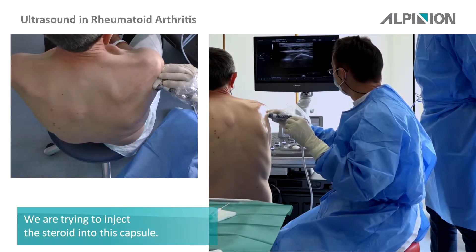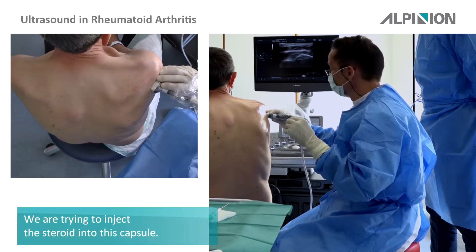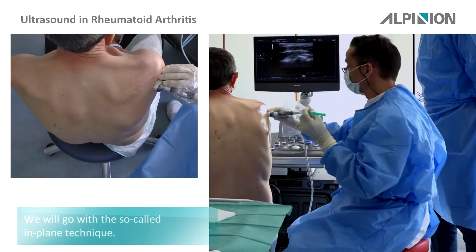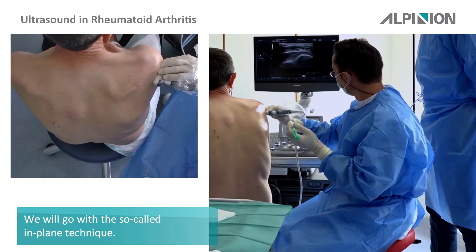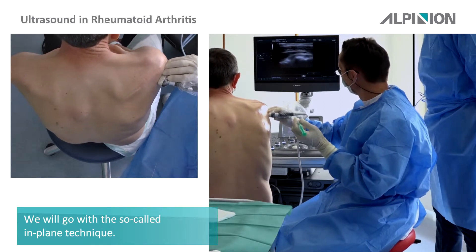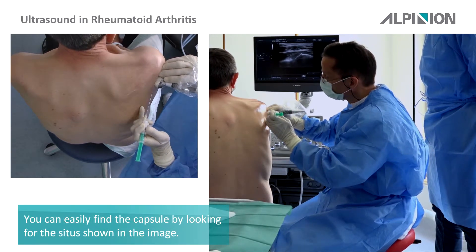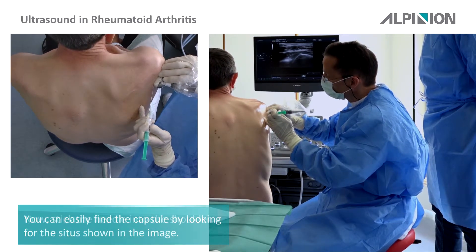We will now inject — we try to inject the steroid into the capsule. We use the so-called in-plane technique. I look at the capsule, then I look at the situs. Now it stings a little.